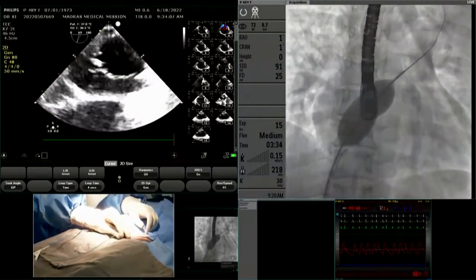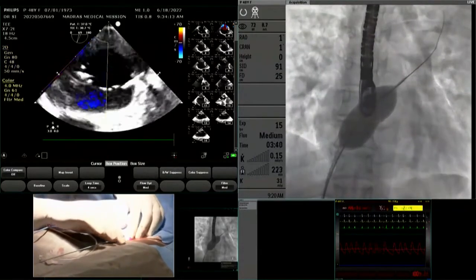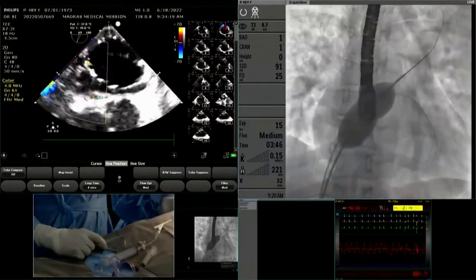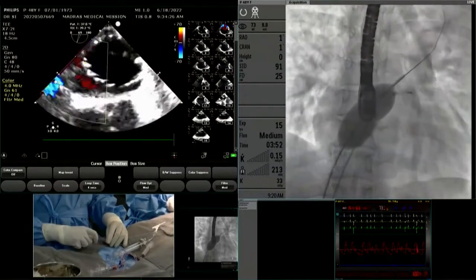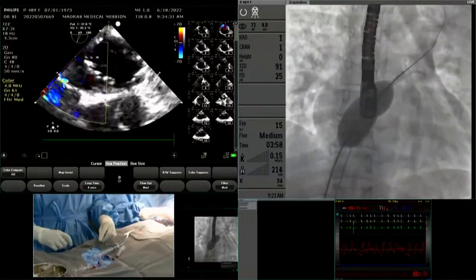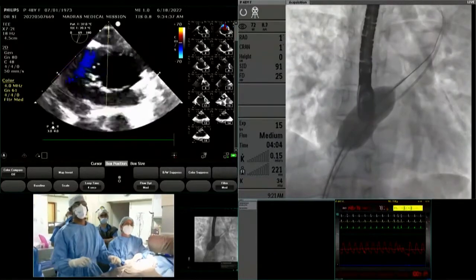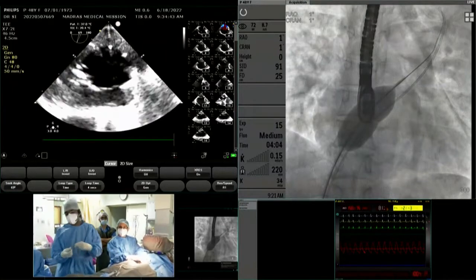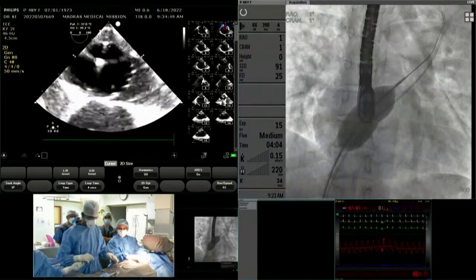So what we practice in our center is this kind of approach. I agree with Shiva totally that balloons are important when you have defects close by, and what he is demonstrating is perfect. But the alternative methods, you go from SVC and then cross the anterior superior, go from IVC and cross that, may be a reasonably good alternative to the methods being demonstrated today. I cannot disagree at all with you, Nageshwar. Your points are quite valid. And a large inflated balloon within the right atrium is going to be a space-occupying lesion in the right atrium and try to prevent us from engaging.